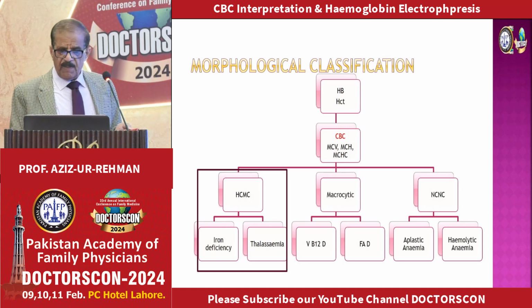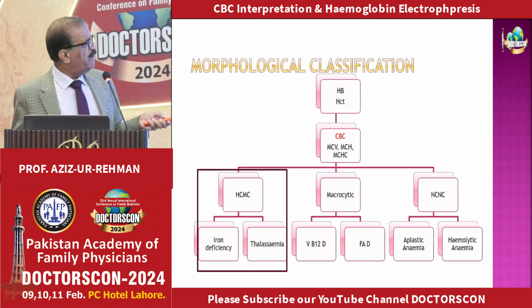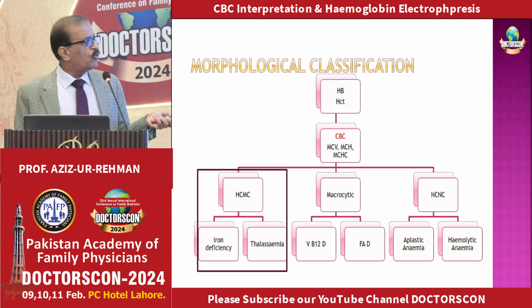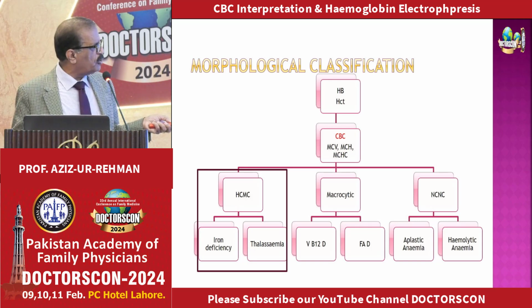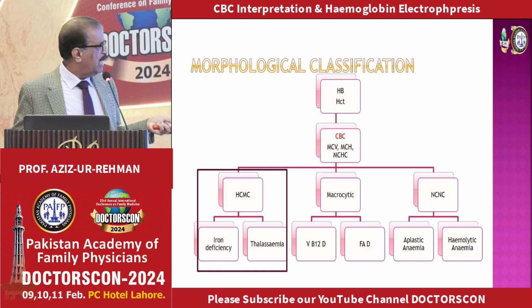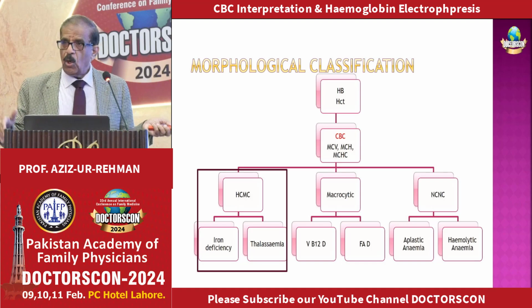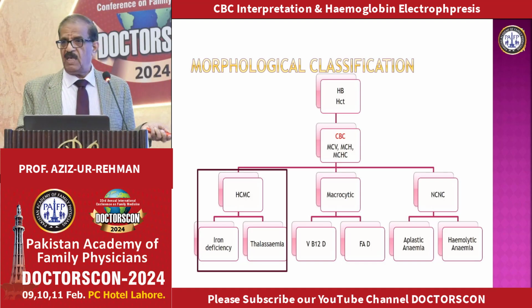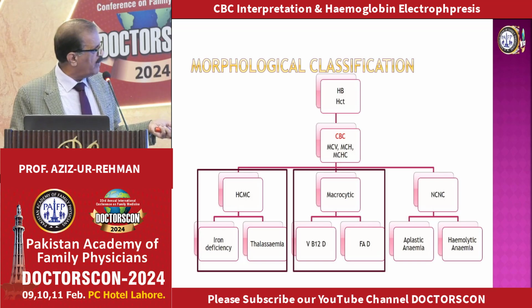Okay. Now, coming to the end, this is how you go. First you see hemoglobin, hematocrit. If it is low, go to the CBC, decide which pattern the patient has: hypochromic microcytic picture, macrocytic picture, or normochromic normocytic picture. In hypochromic microcytic picture, iron deficiency is the diagnosis by default. If iron deficiency is unlikely, or you have some reason to suspect thalassemia, then you will go for electrophoresis. Here you will go for the iron study.